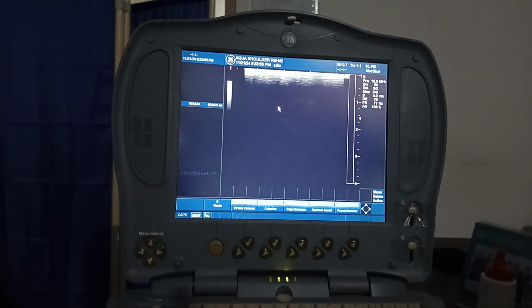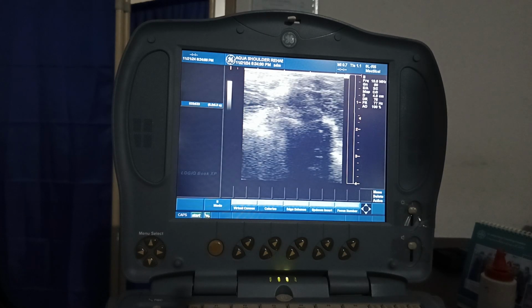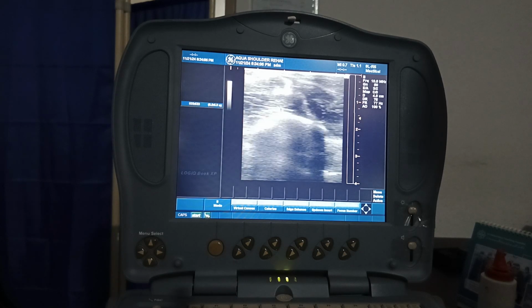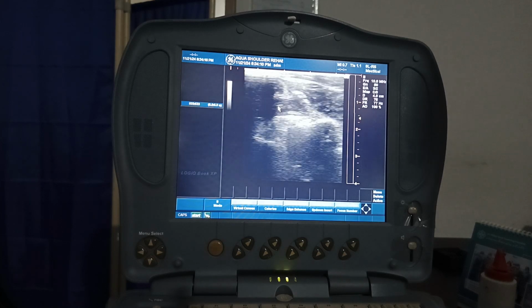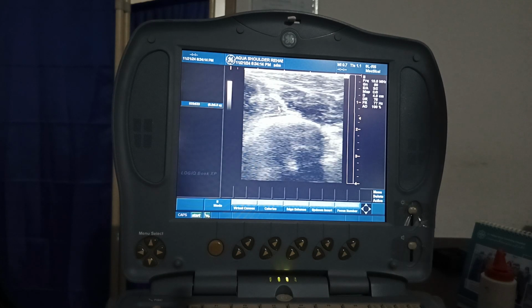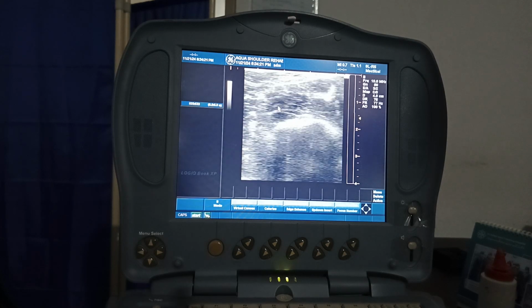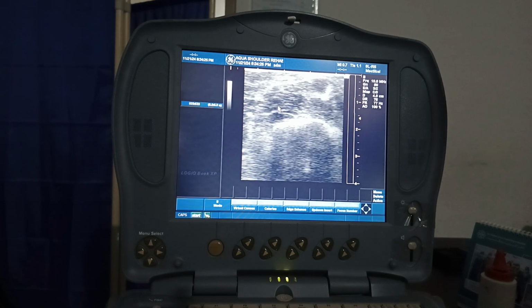So let's try to see again on you. It has to be over here, but I think you do have very tiny blood vessels. Or is this different? There it is, just above the, see, just above the arrowhead.